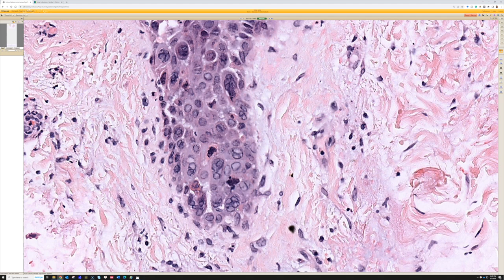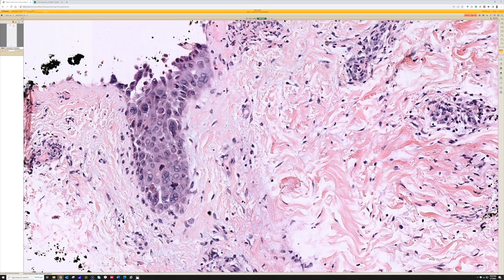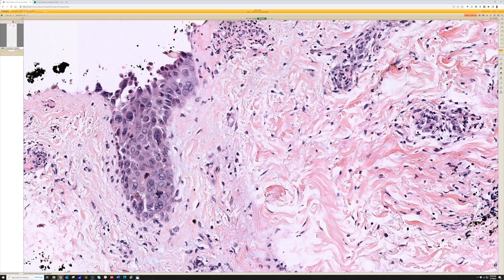The cytopathic change looks the same for both HSV and VZV, at least to my eye. The clinical presentation usually helps: if it's spreading along a dermatome, then it's zoster; if it's a lesion on the lips or genitals, it's more likely simplex. One microscopic clue is that a lot of hair follicle involvement tends to be more common in varicella zoster, because the virus resides in the sensory nerve ganglia and, when reactivated, spreads back through sensory nerves along the dermatome, connecting to the root of the hair follicle and infecting keratinocytes there first before spreading up into the epidermis.